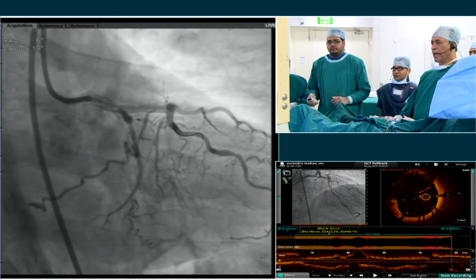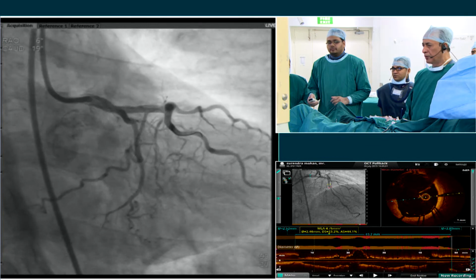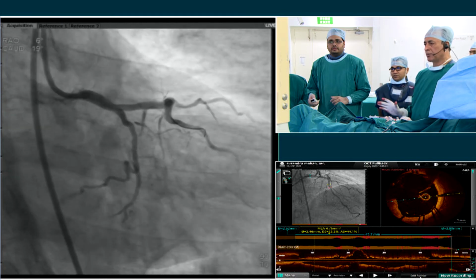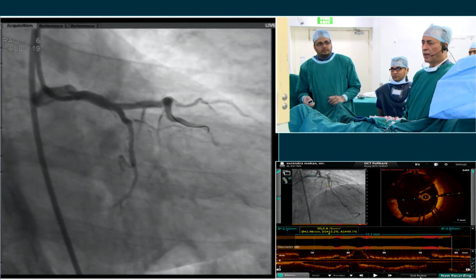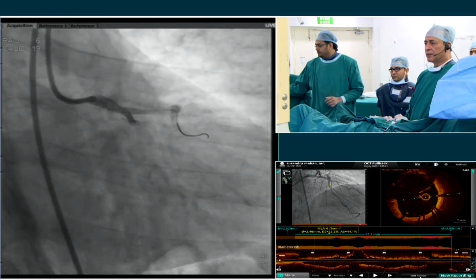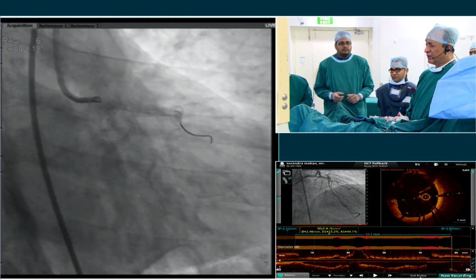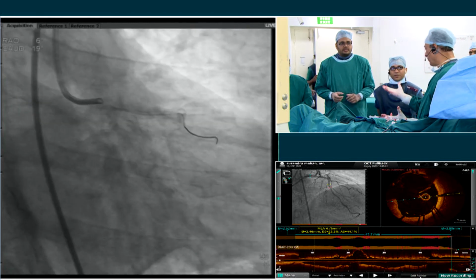And to me, angiographically, it looks fantastic. OCT-wise the stent is well apposed, good result, and the circumflex artery ostium is very good. Flow is absolutely perfect, no residual stenosis. So I hope this patient will have a very good result. And in this type of complex cases, this can be done. Surgery, as I told you, the result at 4 years of surgery versus angioplasty stenting is almost comparable in this case.